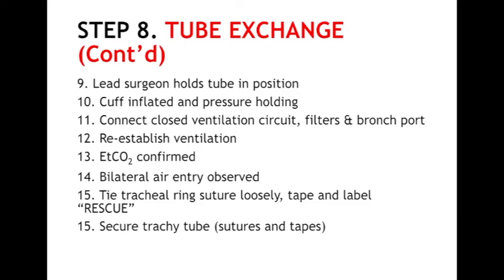The tracheal ring rescue suture is loosely tied, taped and labelled. The tracheal tube is secured with 4-quadrant sutures and tapes, and the wound approximated closed at the edges if required. The surgical procedure is now complete.